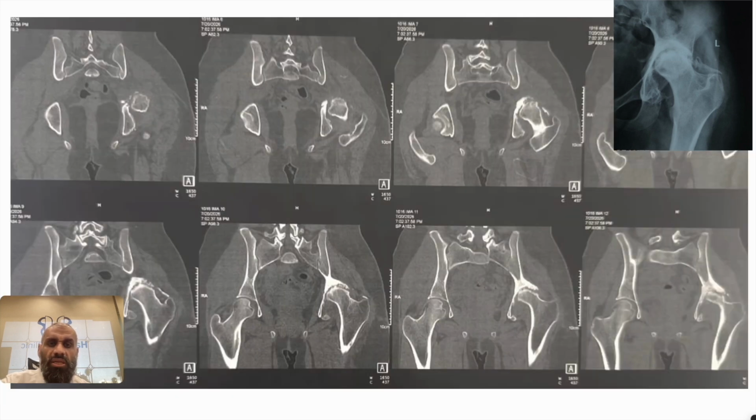So we studied the femoral head for signs of AVN or structural damage to know if the head is a possible source for a good graft or not. And we decided that the femoral head could be used as a biological reconstruction, especially in a very young lady, who is, again, only 15 years old.